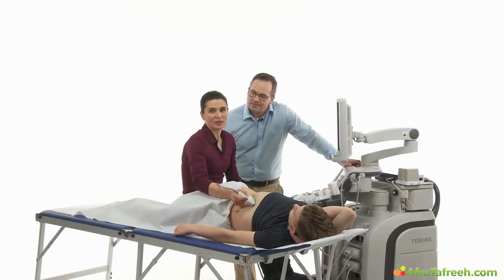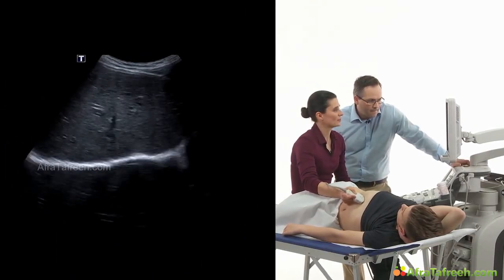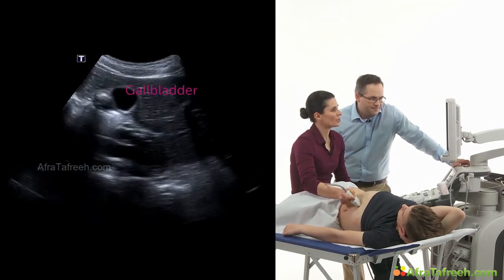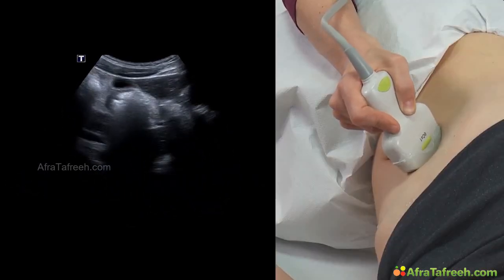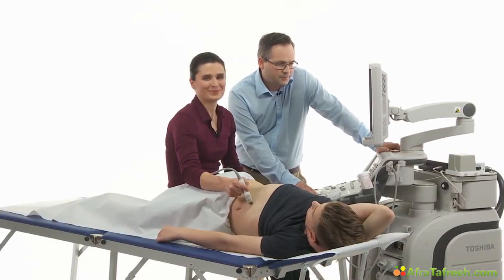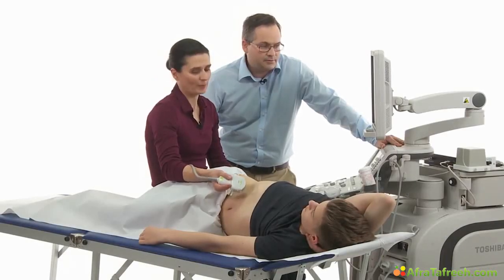And now we proceed until we can see the caudal rim of the liver. Please inhale again. Confluence of the liver veins, jumping deer. And now just tilt my transducer slowly downwards. See the gallbladder over there until I've seen the rim, the caudal rim of the liver. Perfect.